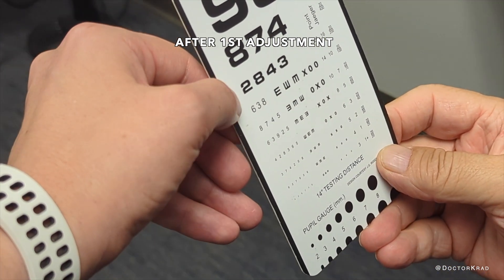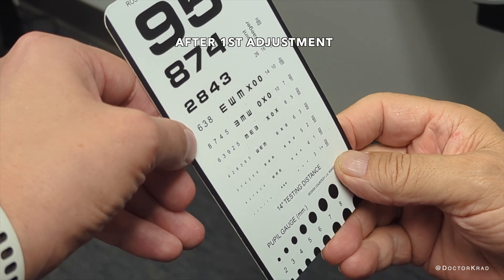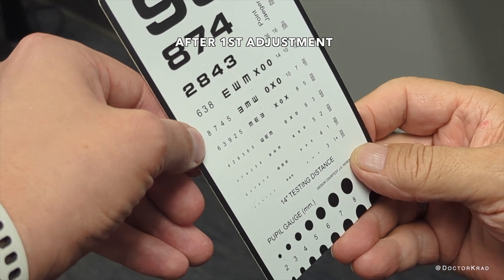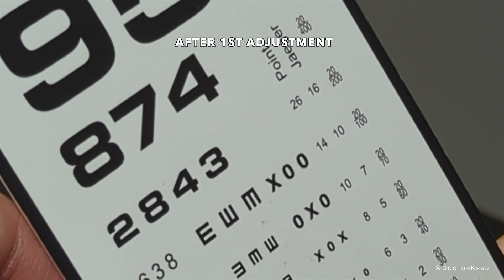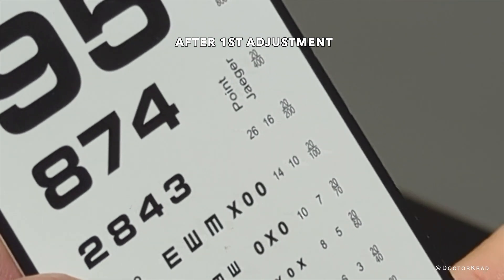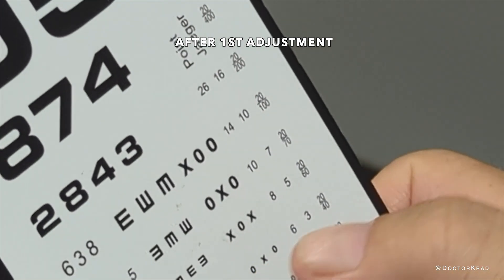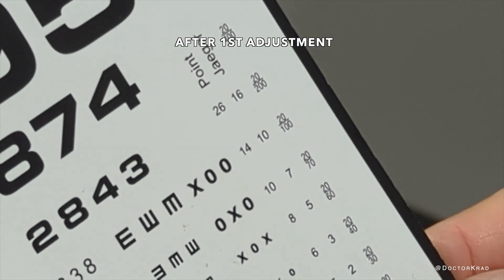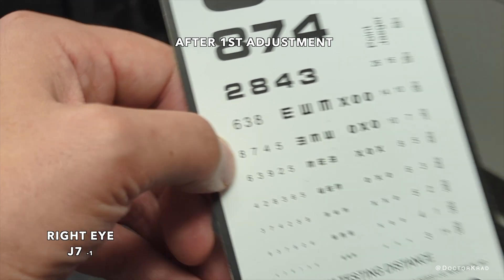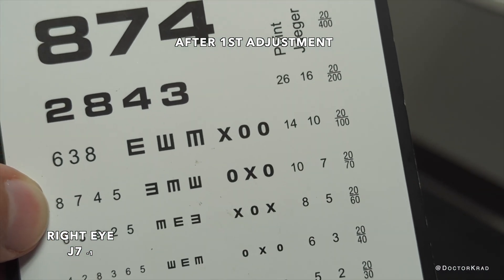Read this one: 2-8-4-3. How about here? 6-3-8. Any of these? In down I6: 7-4-5. 3-8-6-8. So the first one you have trouble with, but the last three you can get. So you're between J7 and J10. How about your other eye? Cover — switch eyes.